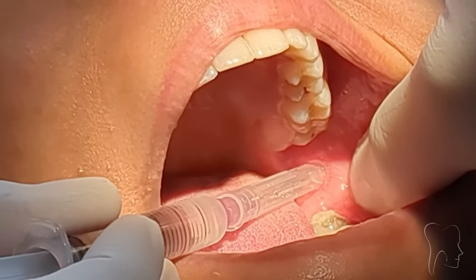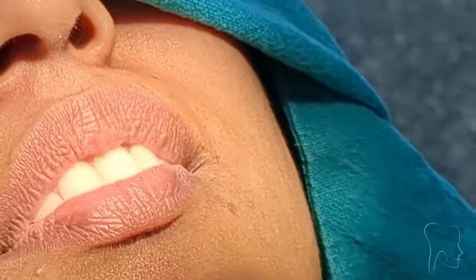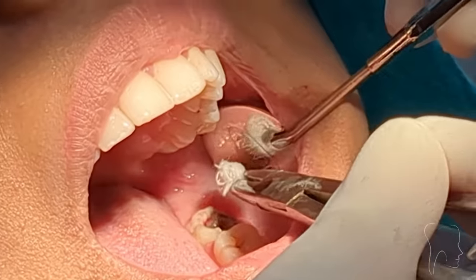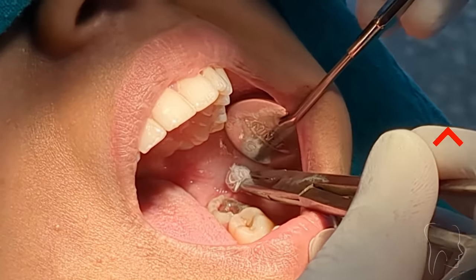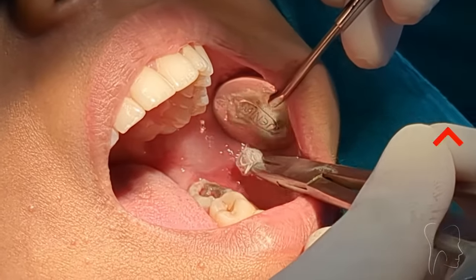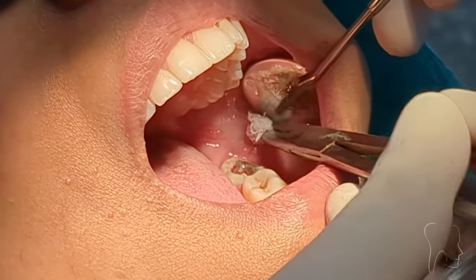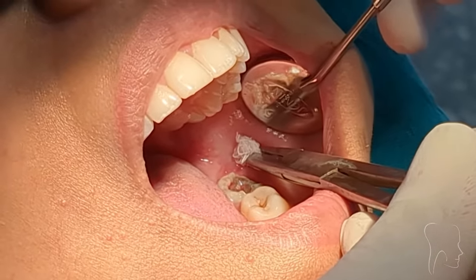The majority of the time, with just these two things, your block will be successful. So I am applying the topical anesthesia at the site of injection for the long buccal nerve block. For the long buccal, the site of injection is buccal and distal to the last molar — here the last molar is the third molar. So I am applying the topical at the buccal and distal to the third molar.